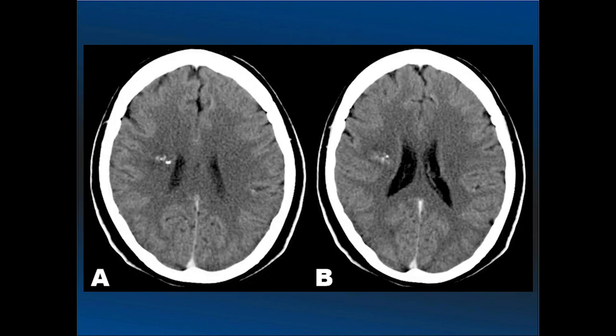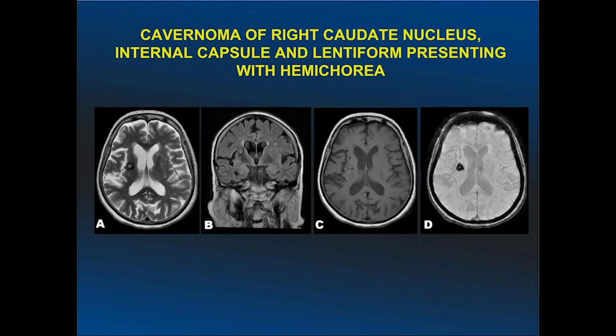We will now show some cavernomas from our cases. This is a right corona radiata popcorn-type cavernoma with calcifications on CT scan. This next case shows a right caudate nucleus cavernoma — this patient presented with hemichorea.